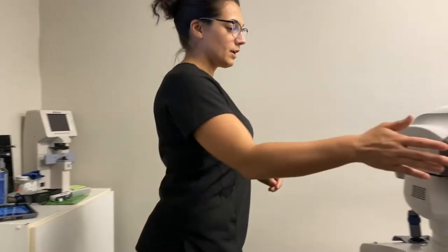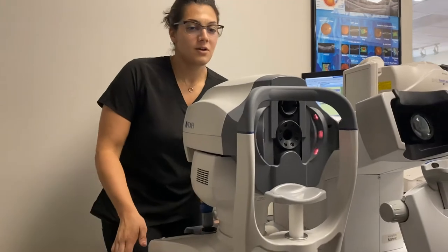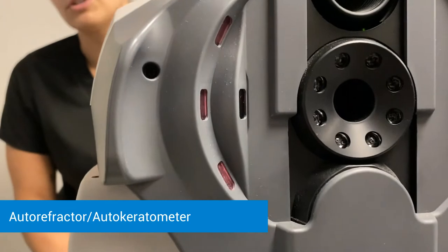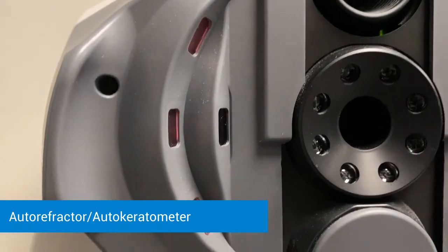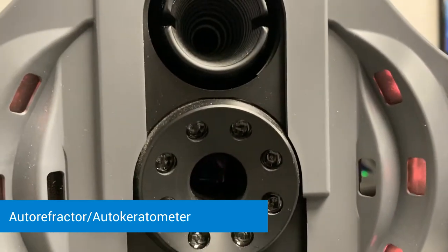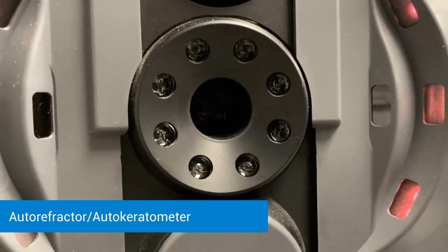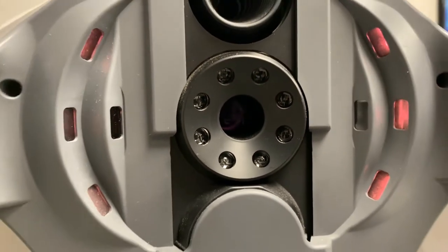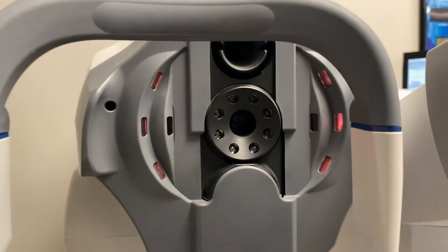We're going to come right up to the autorefractor here. This is going to grab some measurements of the cornea as well as give the doctor an idea of how much correction may be needed if necessary. You're going to put your chin on the chin rest, forehead right against the headrest, and you're going to find a hot air balloon in the center that's going to be coming in and out of focus. Keep staring straight ahead and that's going to take a couple quick measurements.